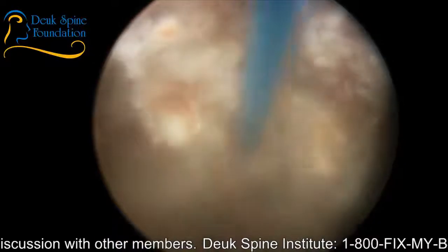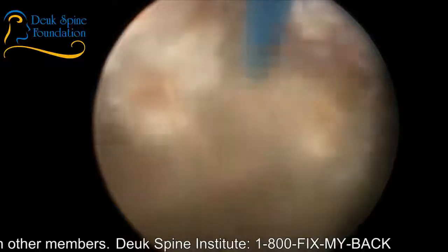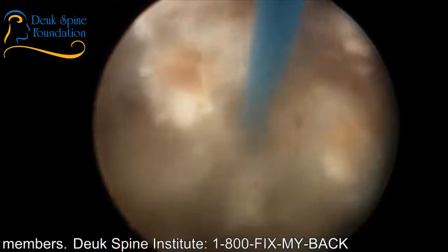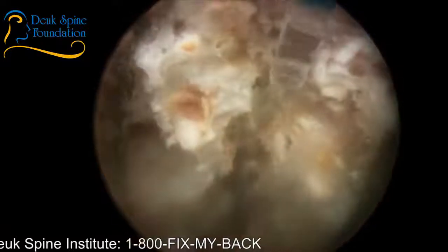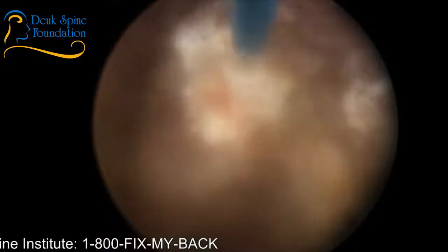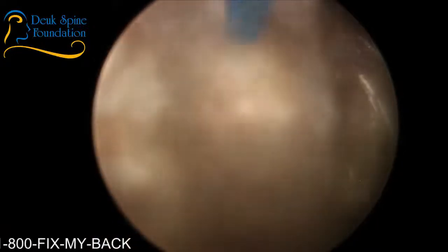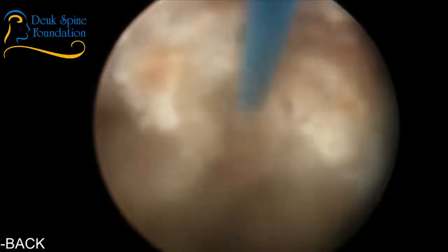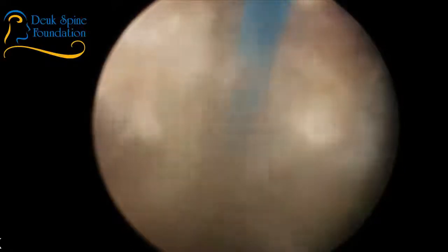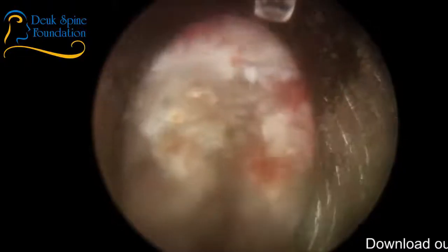None currently. These are all bone spurs I'm removing, by the way, in case you're wondering. For those of you who've watched more of these surgeries, you'll note that this disc looks different, right? This disc does not look like some of the other discs that I've operated on, because there is more bone spur here. And this is more of a degenerative disc, like more advanced degeneration rather than a herniation. Okay?